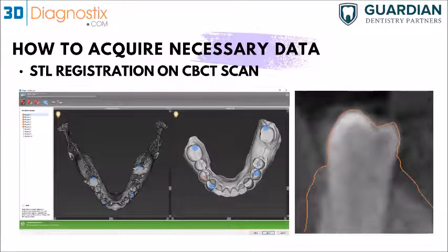So once we've got the patient's intraoral scan or a model or an impression, the feature here in the software that we use is to import that impression or model and try to match the dentition, or the occlusal anatomy as mentioned before, with the occlusal anatomy of the patient scan, which is on the left side right here. So we have a segmentation done of the patient's arch, and then we match the dentition with the dentition on the impression or intraoral scan. And this would be the result.